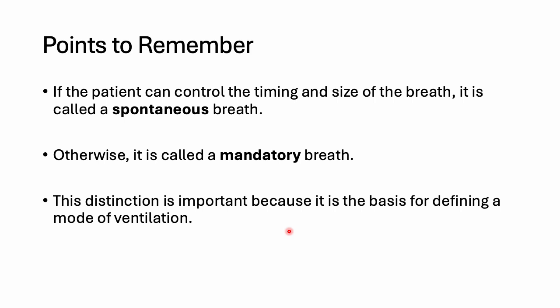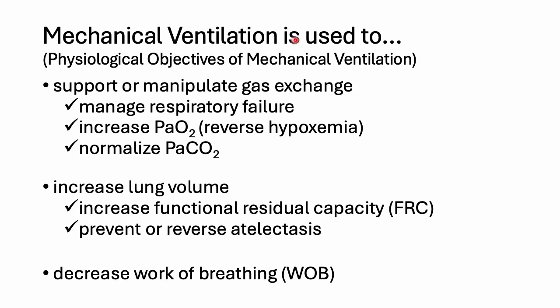And then there are spontaneous breaths and machine breaths. Okay, so within machine breaths, there are different types of modes which we'll cover in the second lecture. Before we go to the second lecture, I need to talk about what mechanical ventilation does, in other words, the physiological objectives of mechanical ventilation.